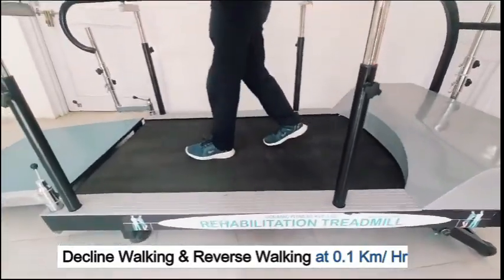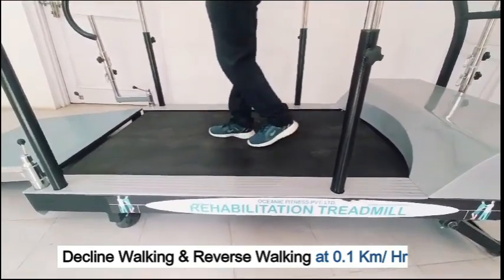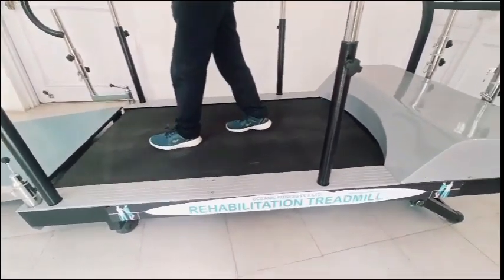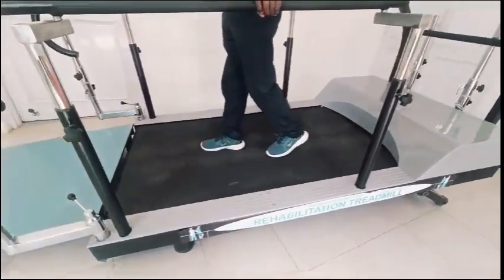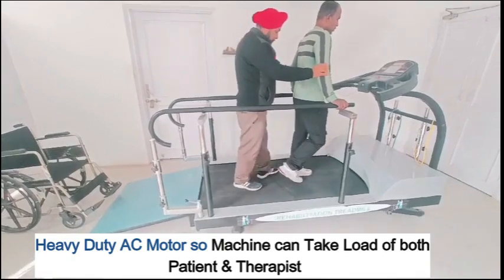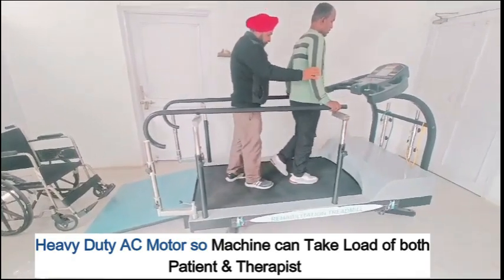Decline walking and reverse walking are supported at 0.1 km per hour. The heavy duty AC motor allows the machine to take the combined load of both the patient and the therapist.